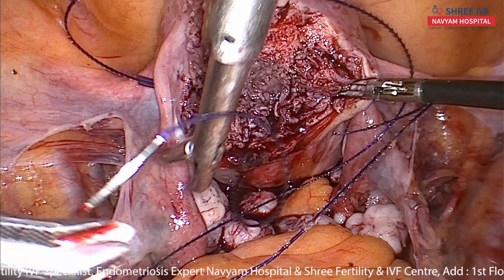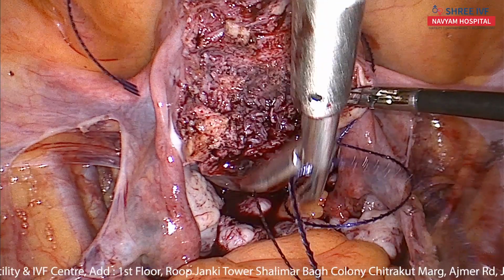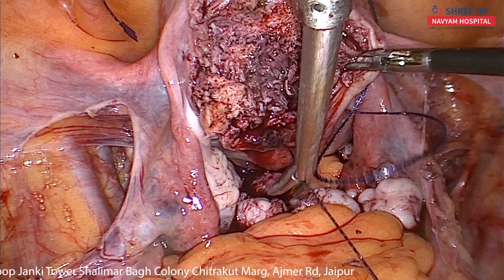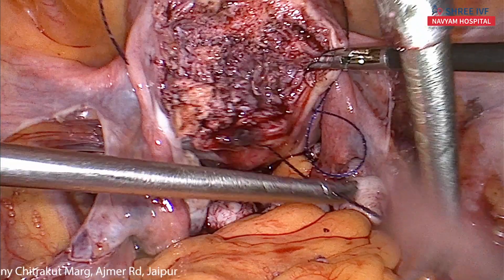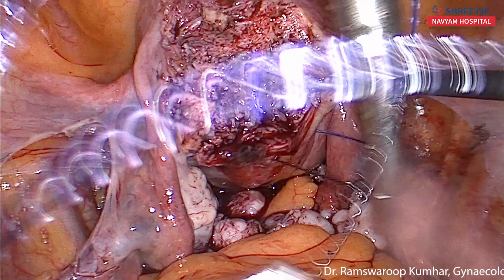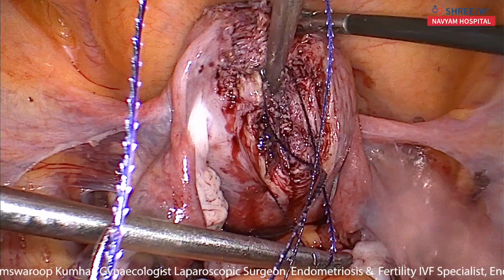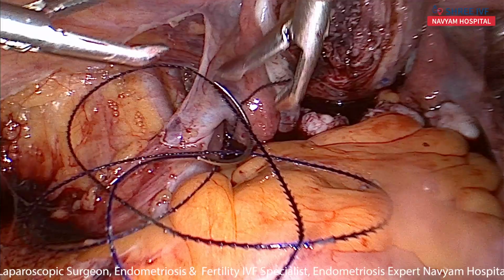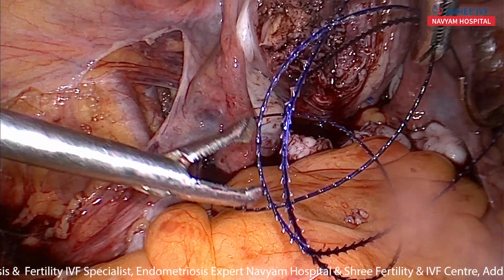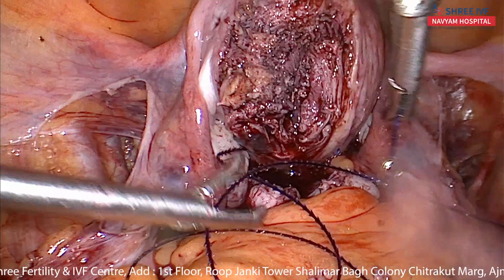This middle port suturing I have learned from our beloved Dr. Jay Mehta, and it's very helpful for the posterior wall suturing. No, you should take it like this. This is also a larger number of the suture.